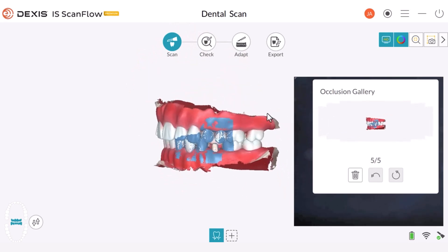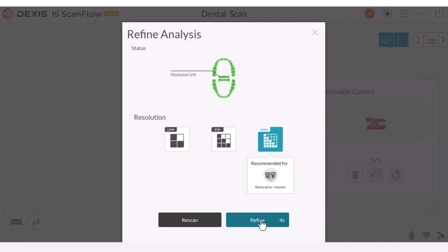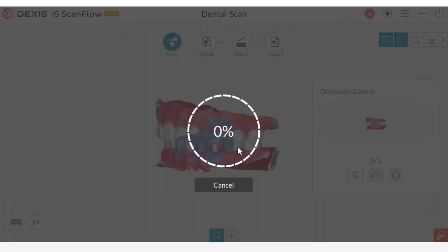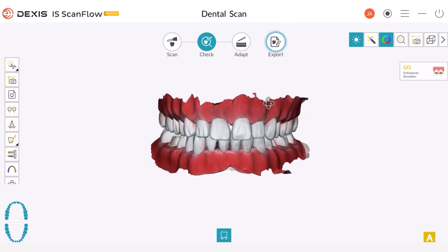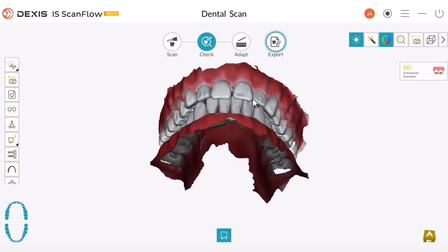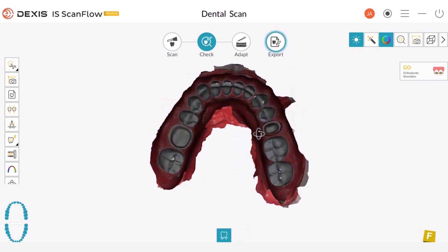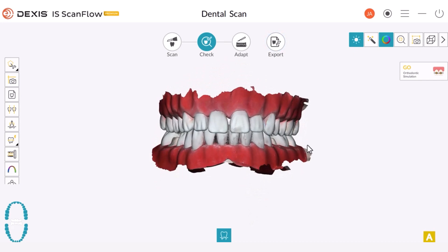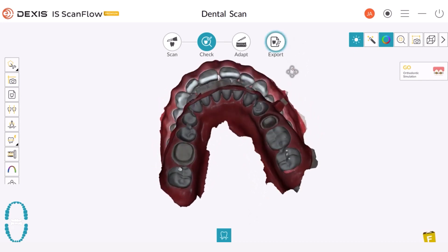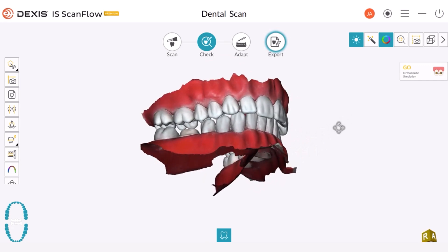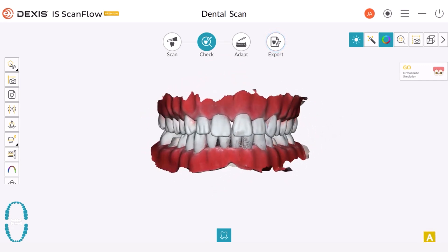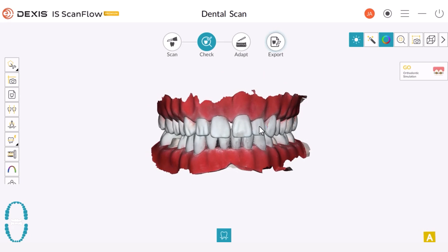When ready, select check and proceed with refinement. Afterward, review the final result with a finished model on the screen. It is important to look and make sure that the holes where the cusps are sticking through are small. Also make sure that there is no open bite anywhere. To confirm the quality of your scan, use the Occlusion Proximity Tool.